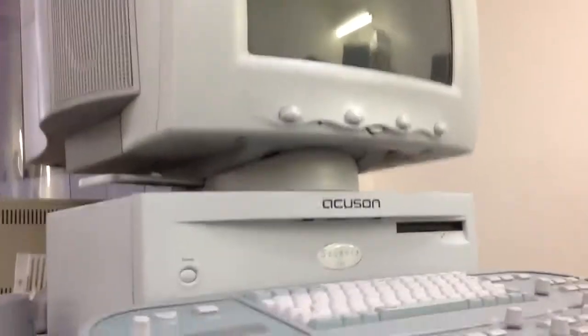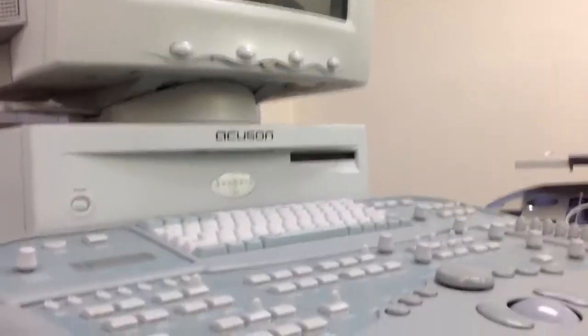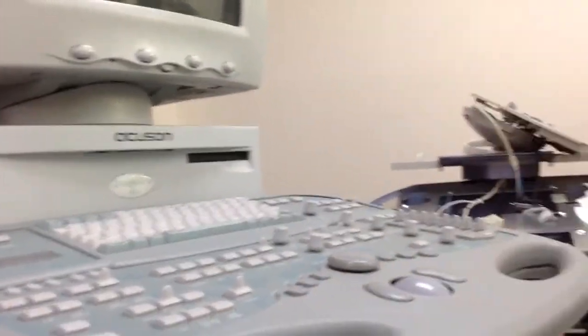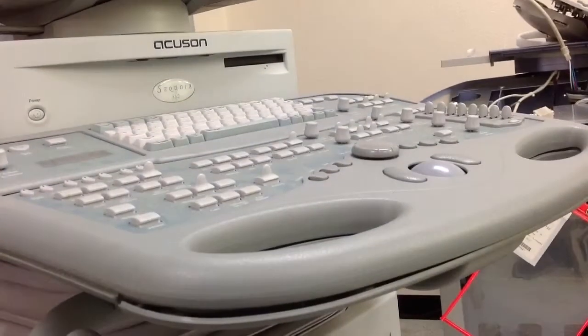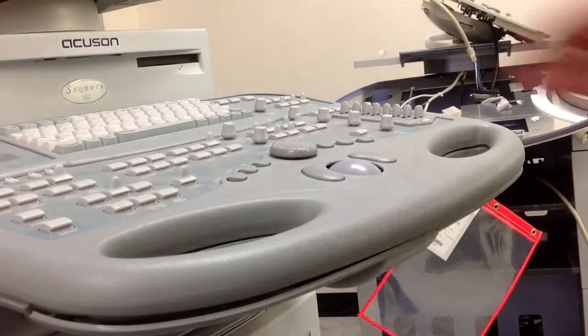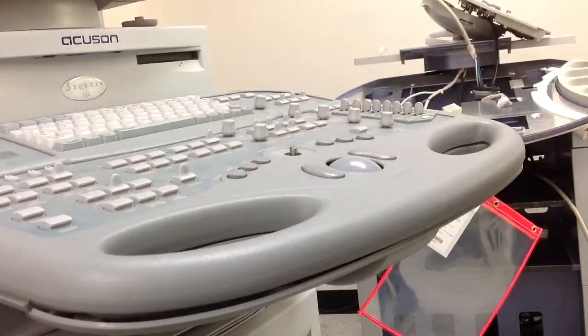Once you remove the screws, you will need to remove the freeze knob. Let me position my camera here so I can use both hands. Alright, remove the freeze knobs, and then you can remove now the keyboard bezel.